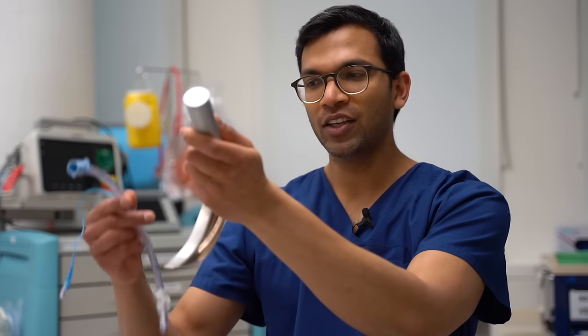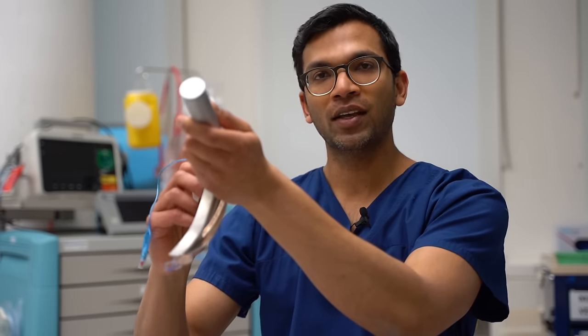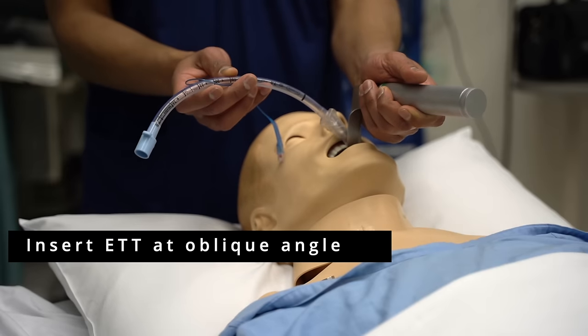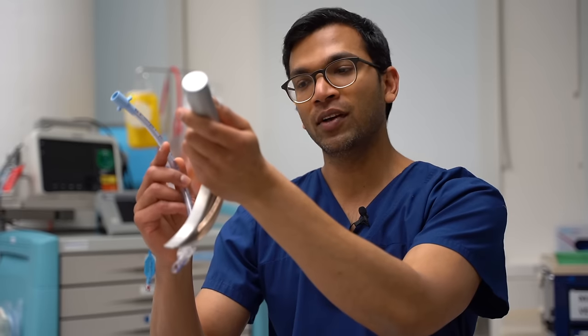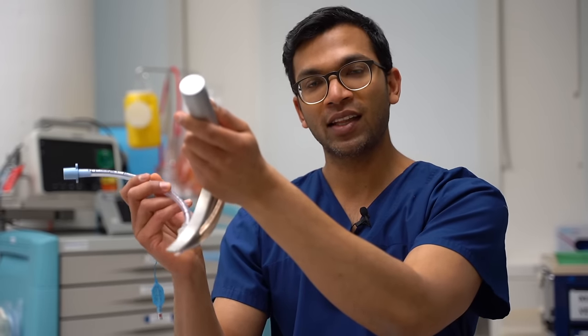Now for a couple of last tips. Imagine you've got a really good laryngoscopy view — a great view of the cords — and you're about to place your tube. Intuitively you want the tube to follow the contour of the laryngoscope, but that actually blocks your view so you're never really sure if your tube is in there. A simple maneuver: just turn your tube laterally, so it's horizontal. That way you can see the larynx, see the cords, and watch the tube passing in — it only requires a clockwise lateral rotation of 90 degrees.